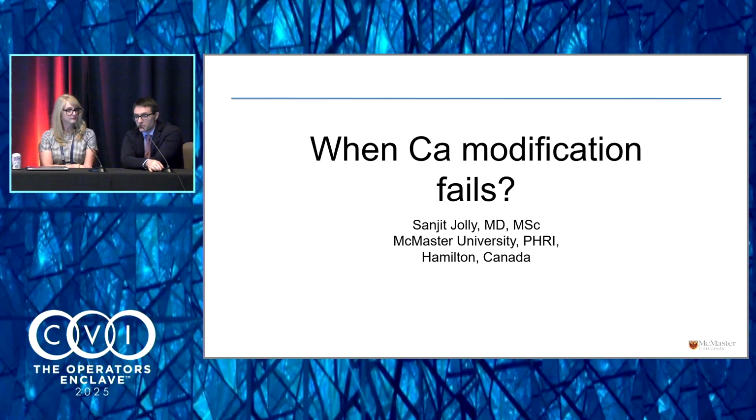Yes, thank you for the question. I think the presentation can give you a little bit of an idea. Yes, it's needed in both situations. The resistant lesions are not only the evil calcified or nodular lesion. The stent is an issue. The stent is the disease, in most of the cases. In the index procedure, if not well done, without imaging, without proper lesion preparation, the stent still remains an issue. And we have the same experience like you. IVL in-stent doesn't open in the same fashion.